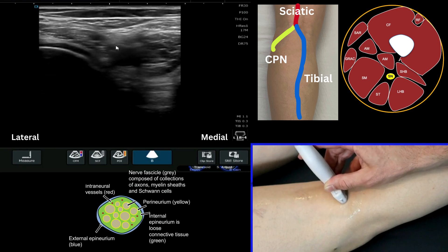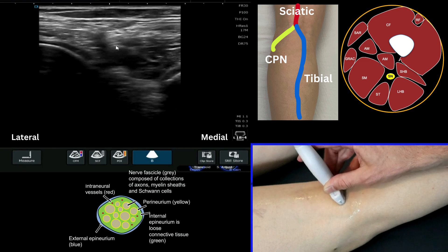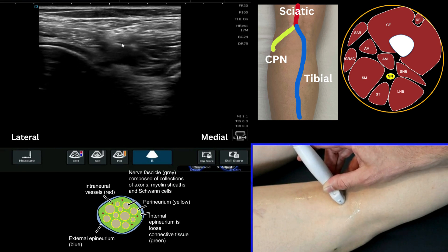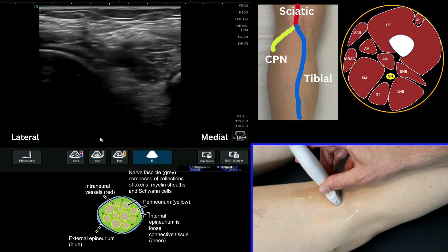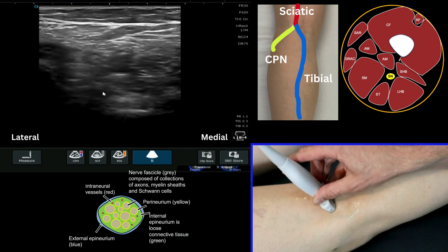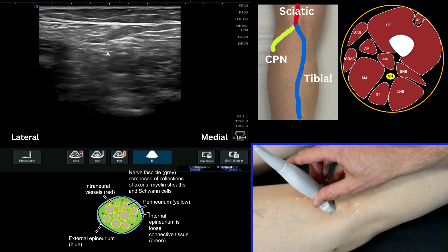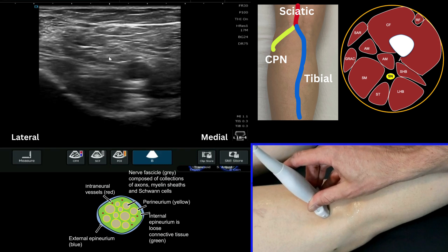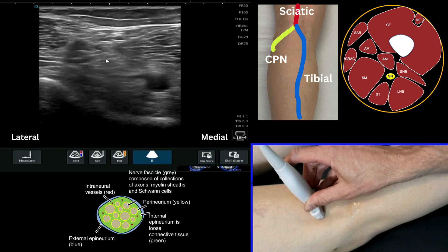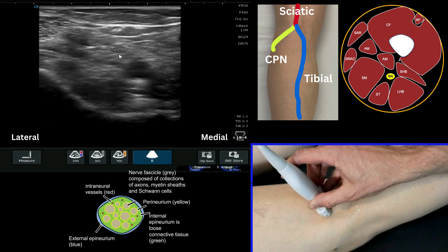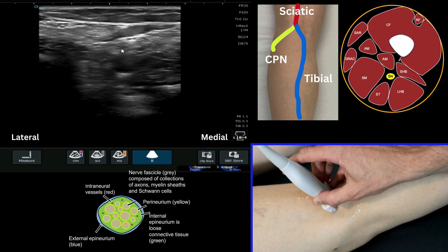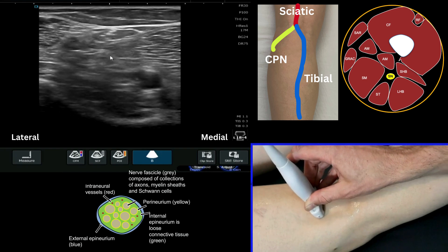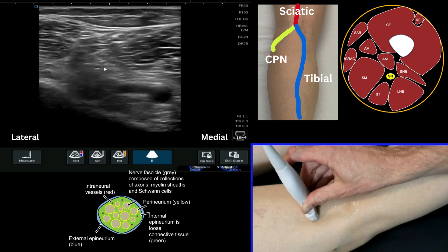To find the sciatic nerve before that bifurcation, you're going to find the structure above the artery and then move your probe more proximally up into the posterior thigh, where you'll start to see the nerve as one structure at this point.